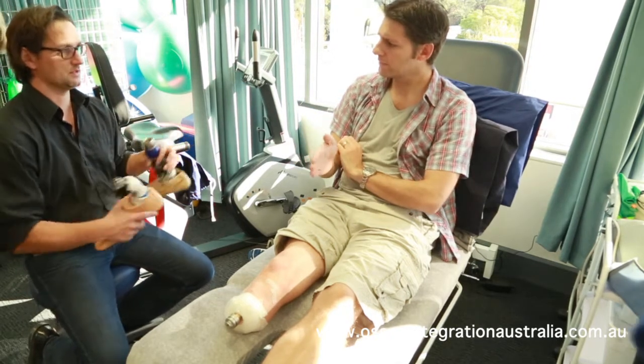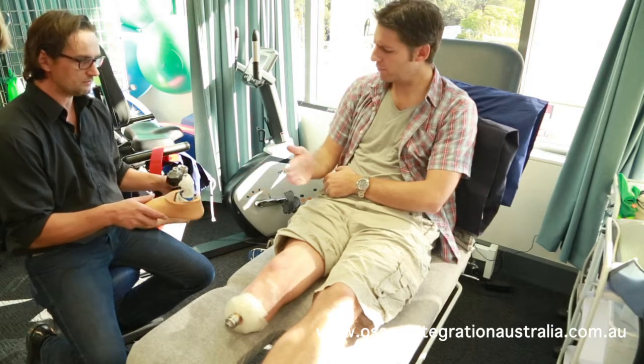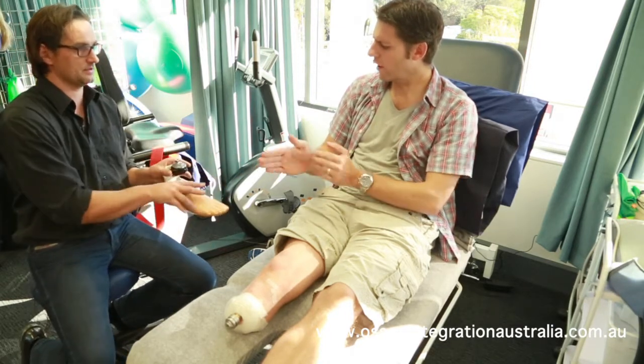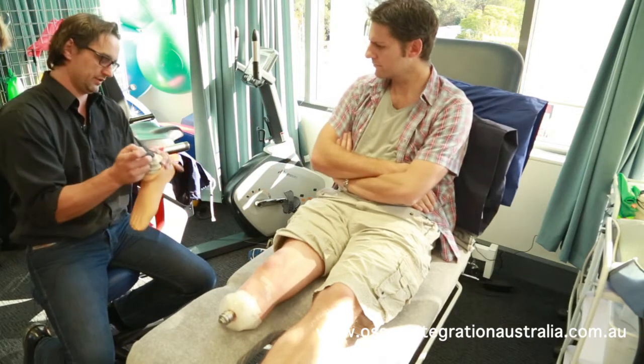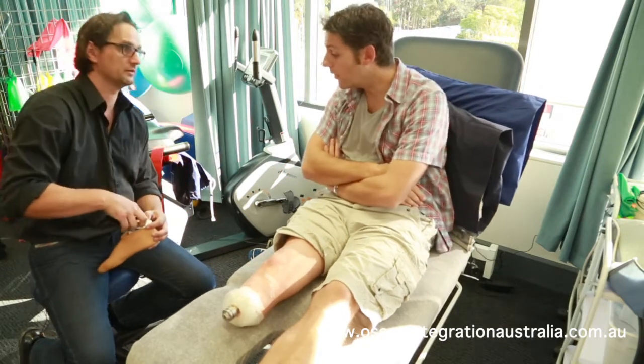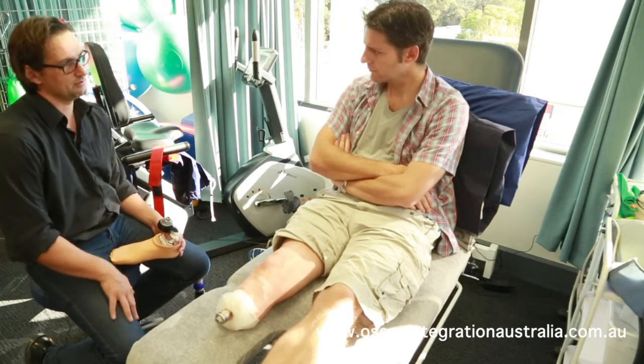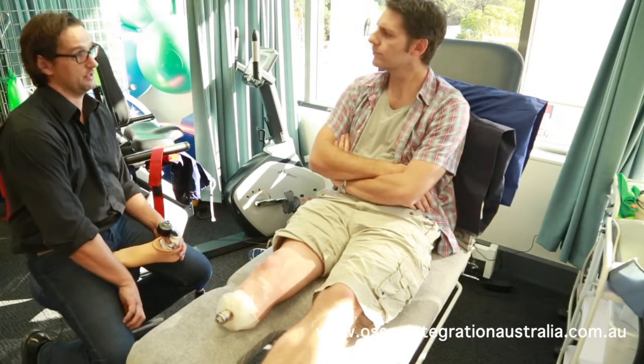Too much this way? Everywhere, just, you know. So this one has a bit of this movement? Only what's in the carbon, because it's got two blades. Right, so they move against one another from that point here, from that point down. It's not a lot. I don't think it's enough for trans-tibial osseointegration, but I don't know — I just don't think it is.